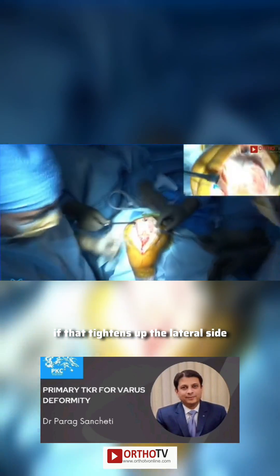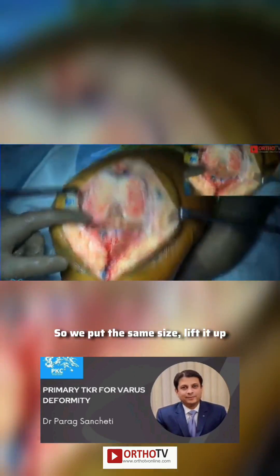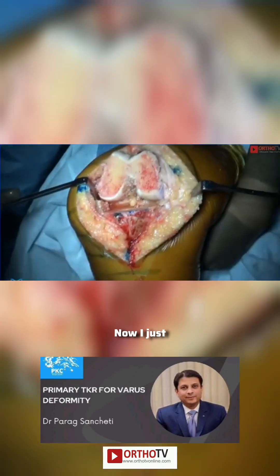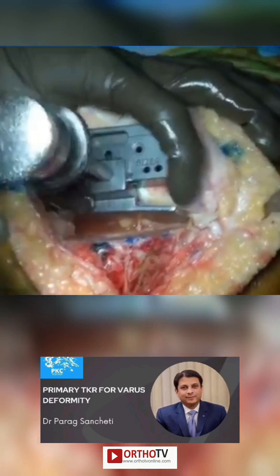So do you now put a bigger spacer block in to see if that tightens up the lateral side? We put the same size — lift up. But it's opening equal on both sides, about two millimeters.